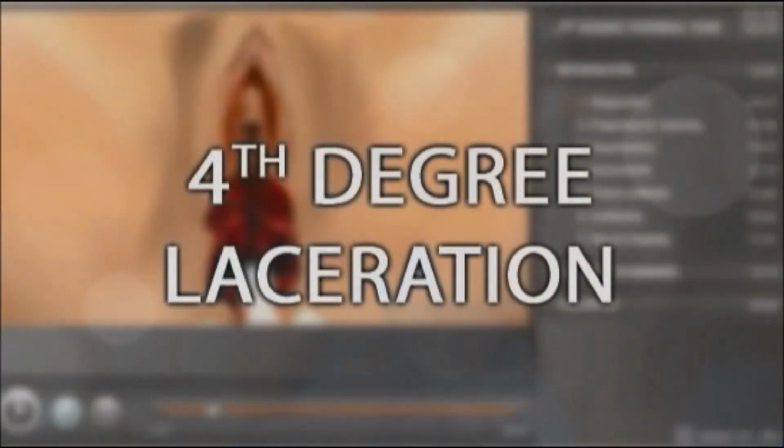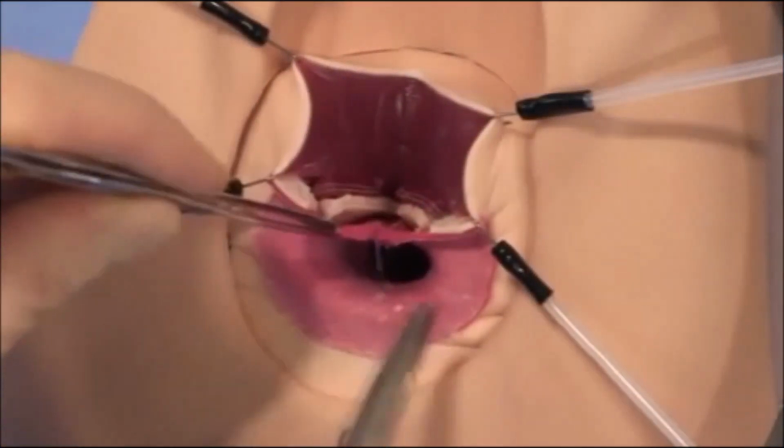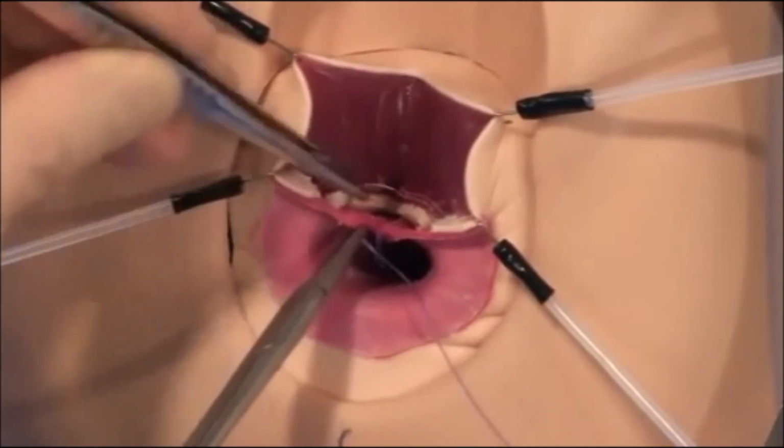The chapter about the suturing of a fourth-degree laceration contains the following: the diagnosis of an injury to the anorectal mucosa. This is illustrated with both illustrations and by showing clinical footage. You can learn about two different methods of suturing. The continuous two-layer technique is shown as a medical animation. An interrupted method is also demonstrated using a medical model.